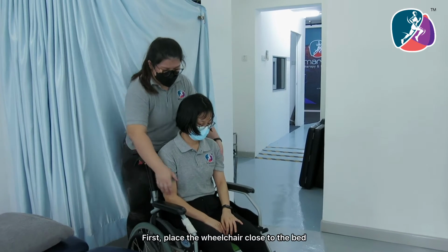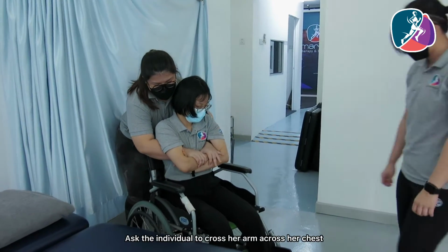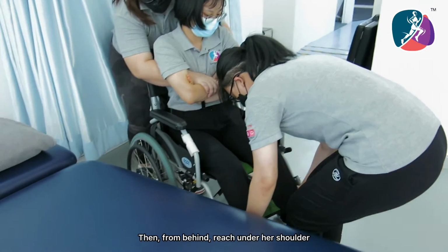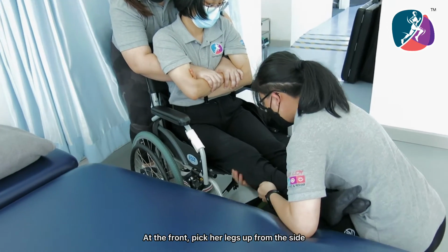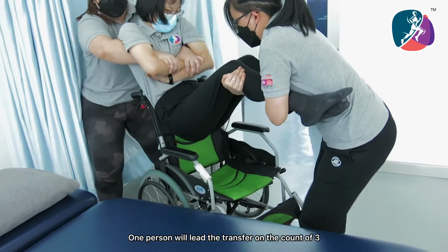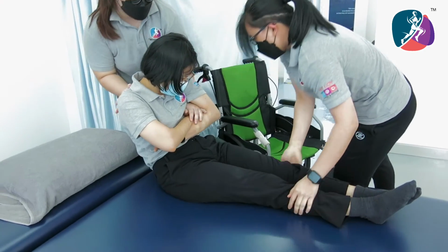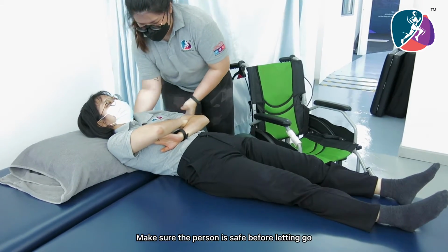First, place the wheelchair close to the bed. Make sure the wheelchair is locked. Ask the individual to cross her arms across her chest. Then, from behind, reach under her shoulder and grab each forearm. At the front, pick her legs up from the side and cradle them in position. One person will lead the transfer on the count of 3. Make sure the person is safe before letting go.